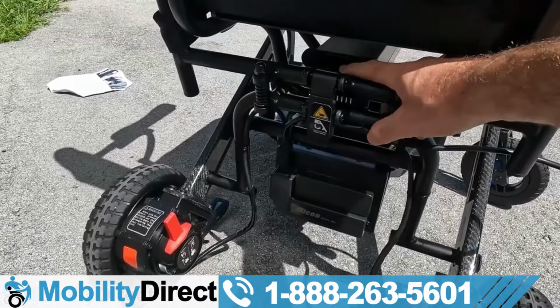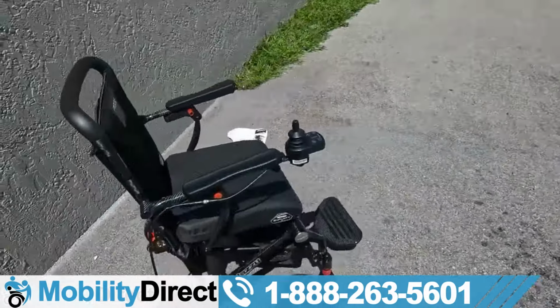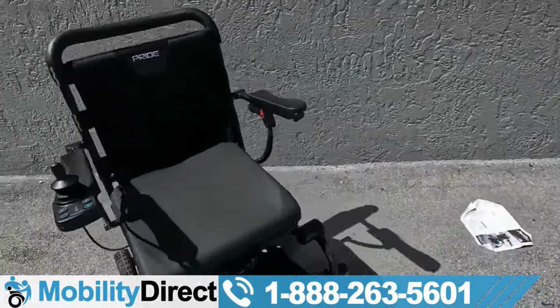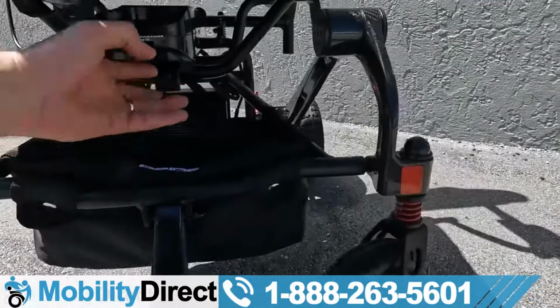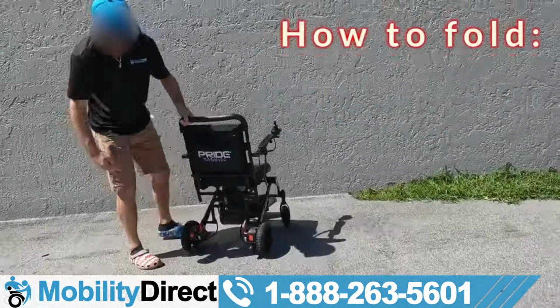Back here is the battery. The battery's got a charging port on it, so you can absolutely take the battery out and charge it, and that will be done right here. I'm going to push this tab up and you can pull your battery up.